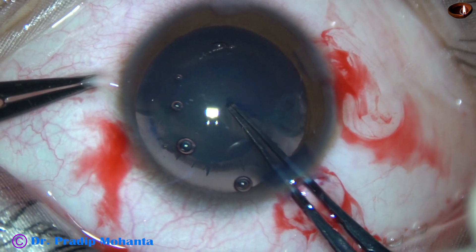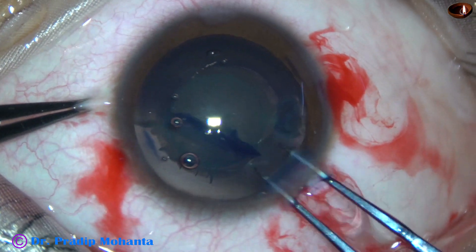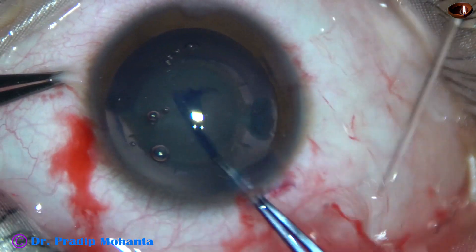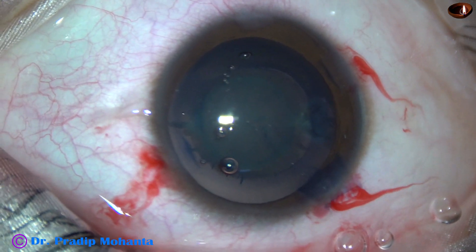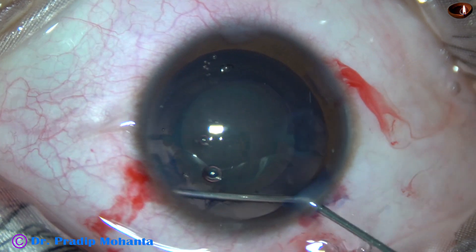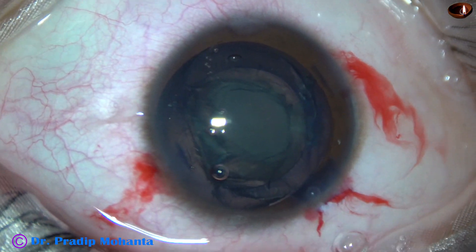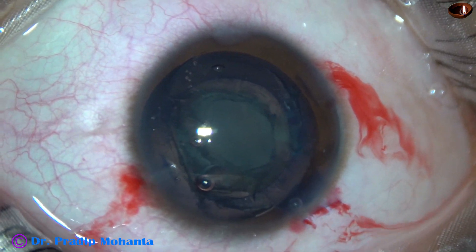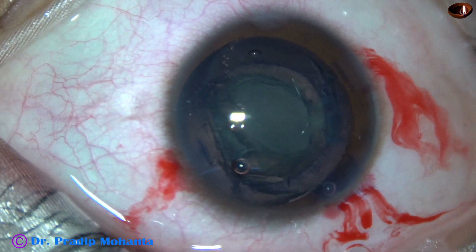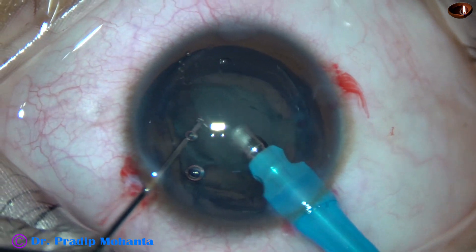Now I hold this capsular tag and balance the centrifugal force with the centripetal, and get a nice 5 mm rhexis. This is possible only with the utrata forceps or a micro rhexis forceps. This is not possible with the needle cystotome. So in pediatric cataracts, always use forceps — utrata forceps, micro rhexis forceps, or Haldipurkar forceps — some kind of forceps.